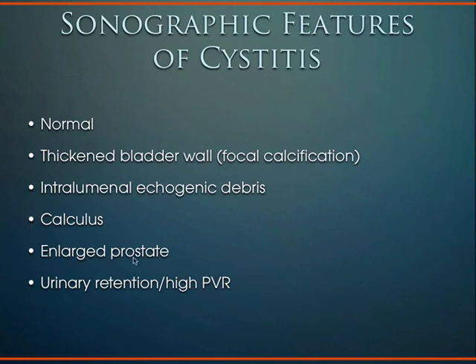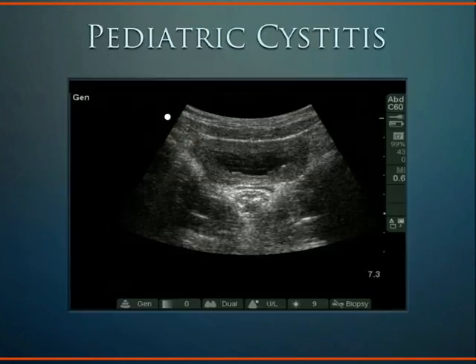Sometimes you can make out on ultrasound, actually quite easily, an enlarged prostate. The patient can have urinary retention or a high post-void residual, which can lead to chronic echogenic debris, which forms calculi and infections in the bladder.